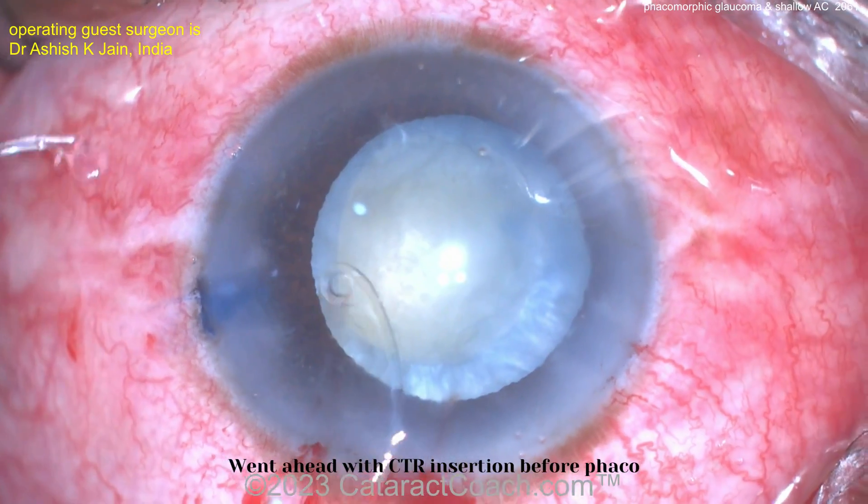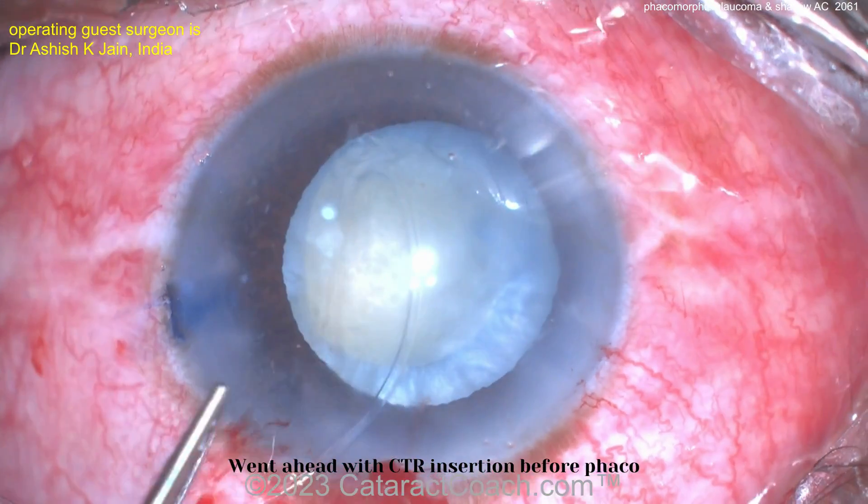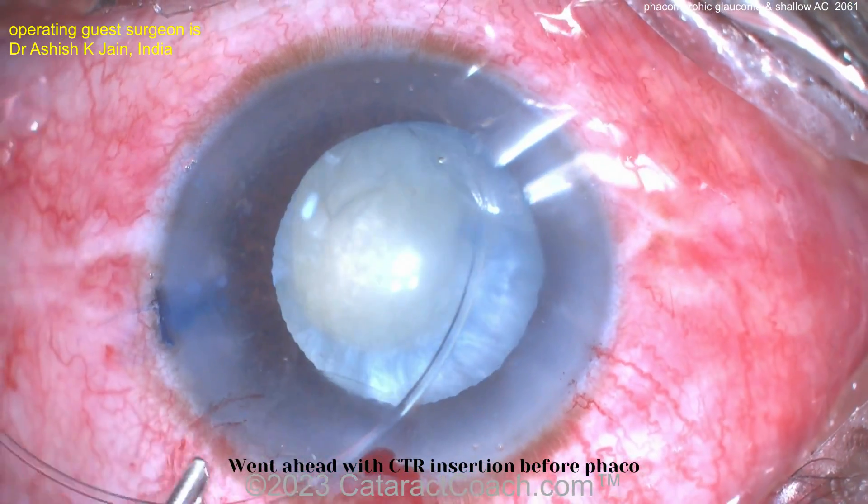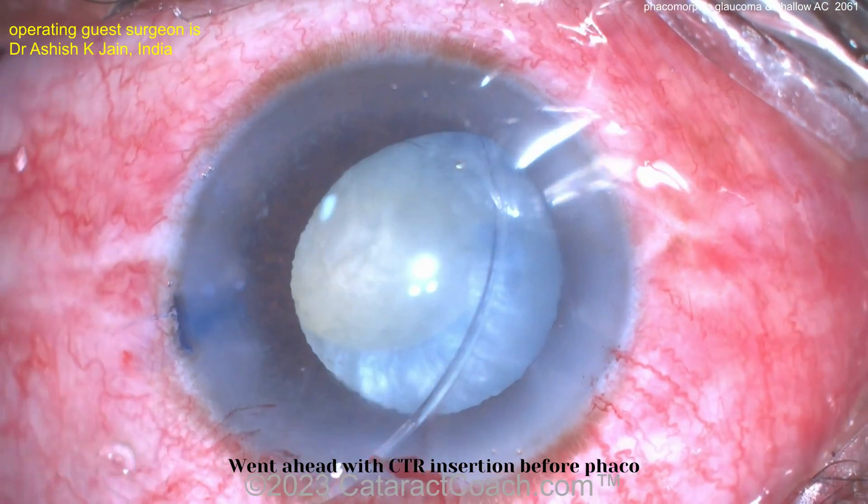Zonular defect — zonodialysis in one quadrant. So now a CTR is going in, manually placing it just with forceps, being very cautious. And that's going in pretty nicely.